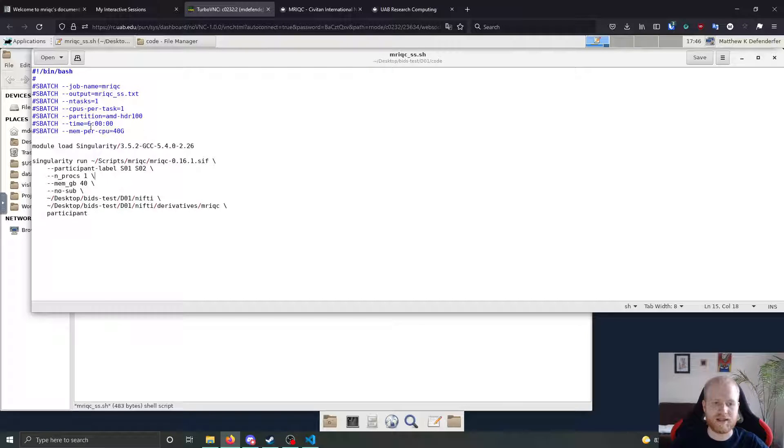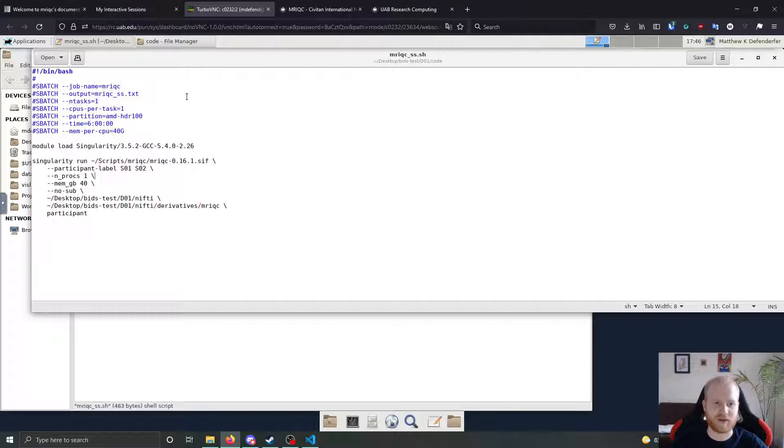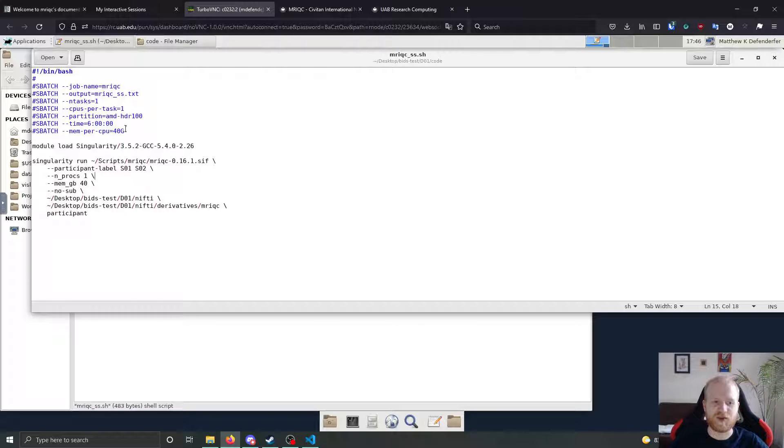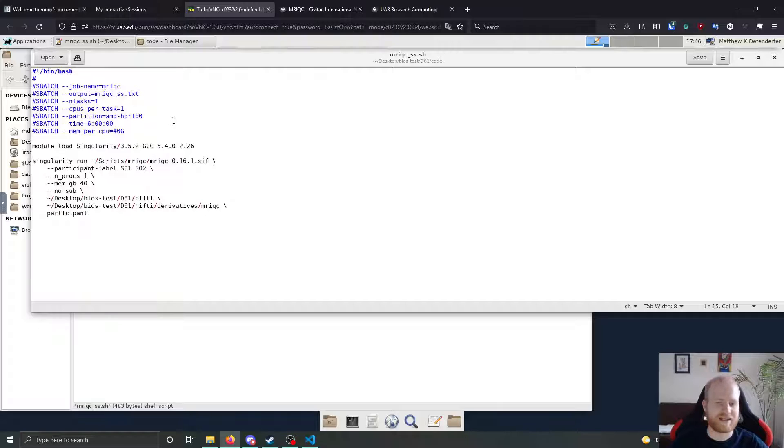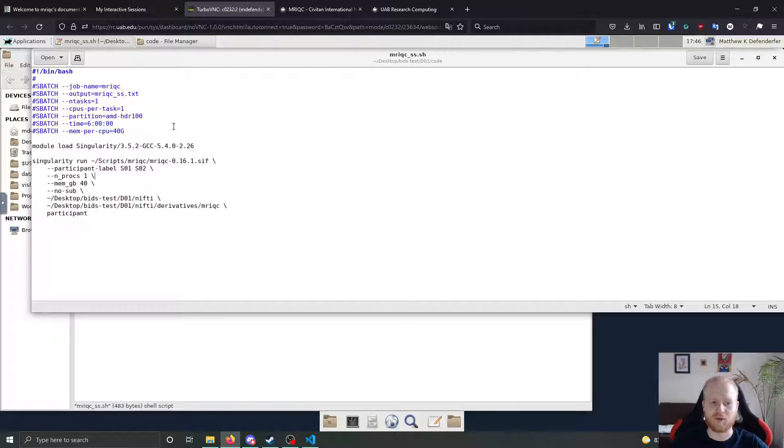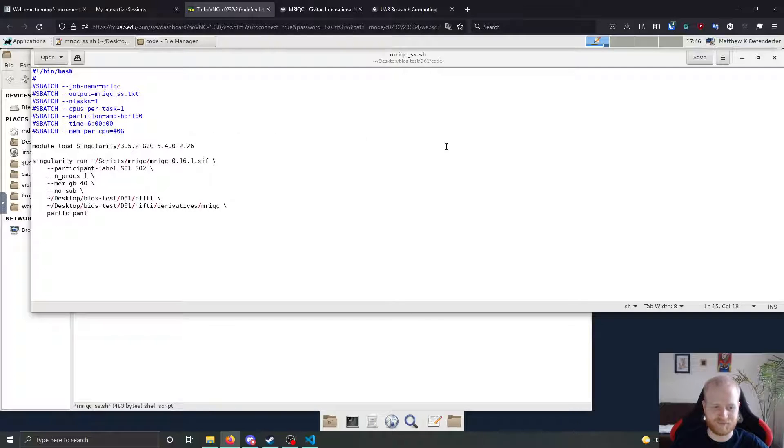In my case, these parameters have worked the best for me so far. With one CPU and 40 gigs of RAM, six hours, it won't take six hours for the job to run, but it gives it enough time to complete pretty handily.